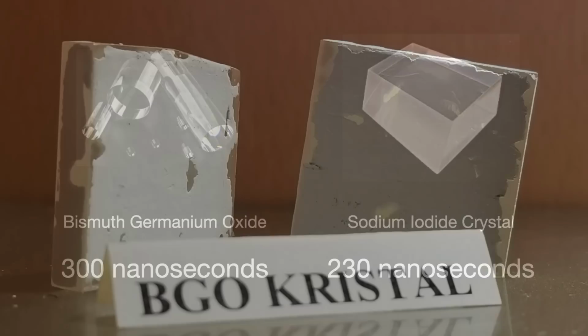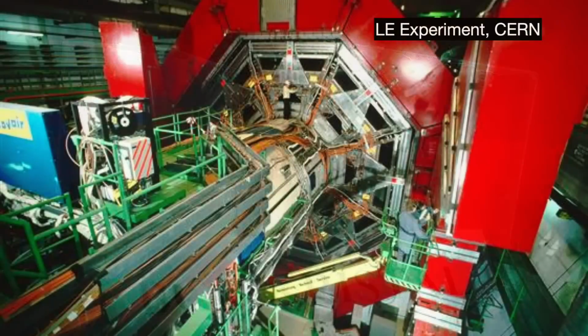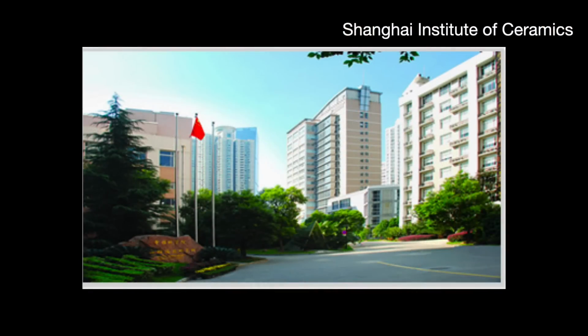Furthermore, years would pass before the PET scanner industry became capable of receiving the crystals in a high enough volume necessary for adoption. This finally came via science work done starting in 1989 for the CERN Large Electron-Positron Collider, one of the world's biggest accelerators. The L3 experiment, as it was called, involved 11,000 or 12,000 24-centimeter long BGO crystals attached to silicon photodiodes. They were produced in China by the Shanghai Institute of Ceramics using the Bridgman method.